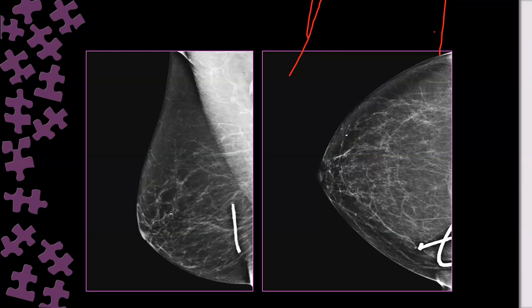Is it a surgical clip from an open heart surgery? Because it's in towards the medial side. Excellent, good suggestion, but it is not a surgical clip. It is something more than that. This lady, she has increased intracranial pressure.